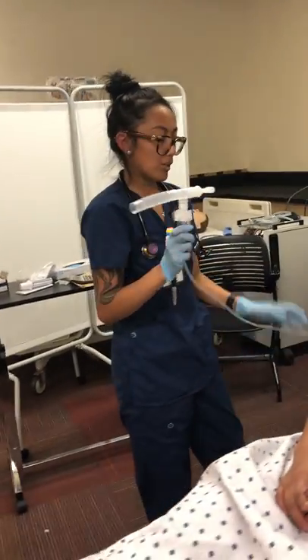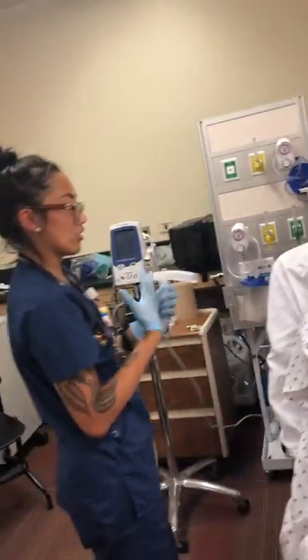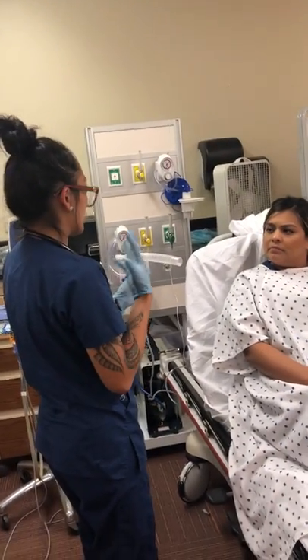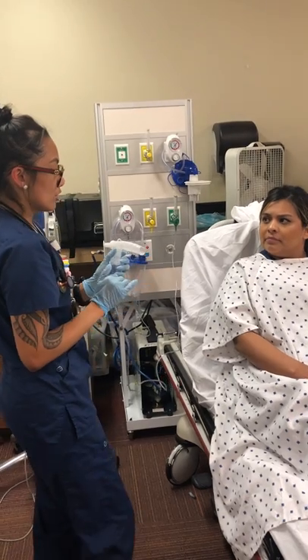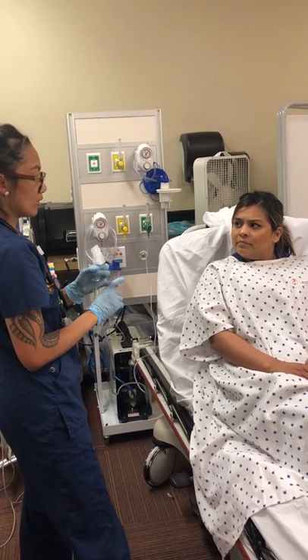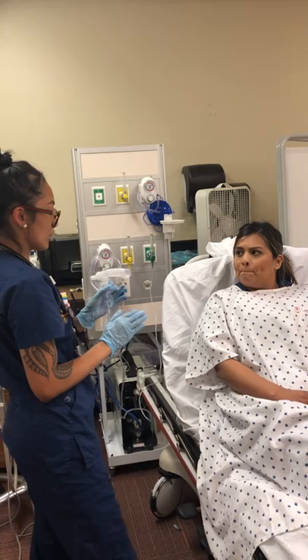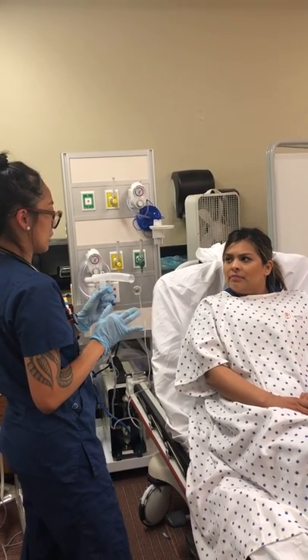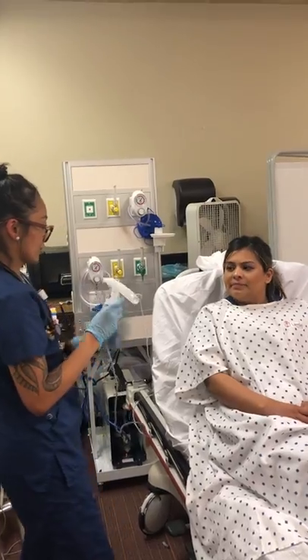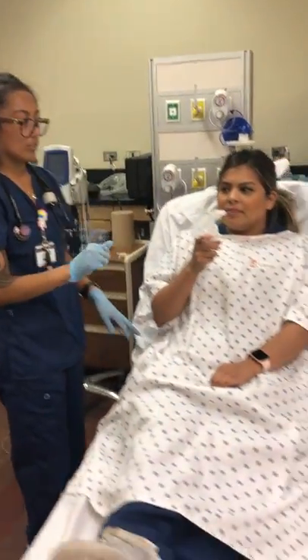There might be some side effects that you might feel from this. You might start to feel like your heart is racing, and you might get dry mouth as well. I'm going to be monitoring you to make sure you don't have any hyper- or hypoventilation. If you start feeling any of those side effects, let me know. The aerosol is starting to come out, so go ahead and do your breathing.